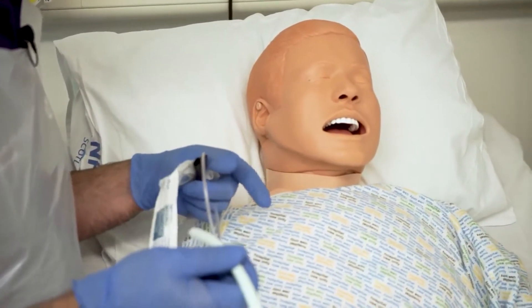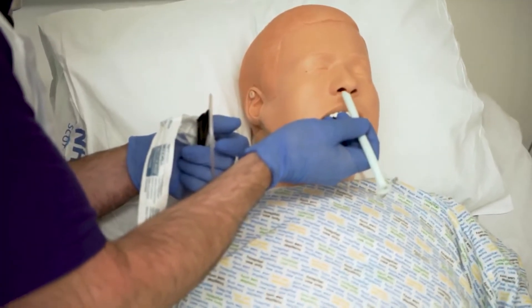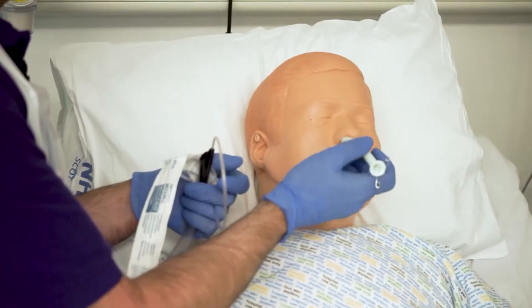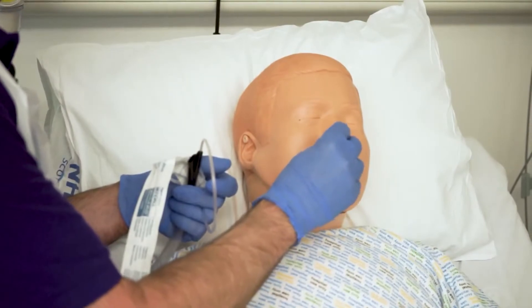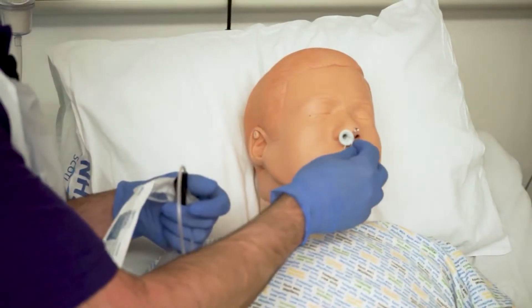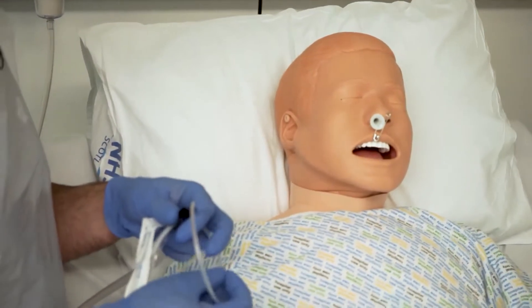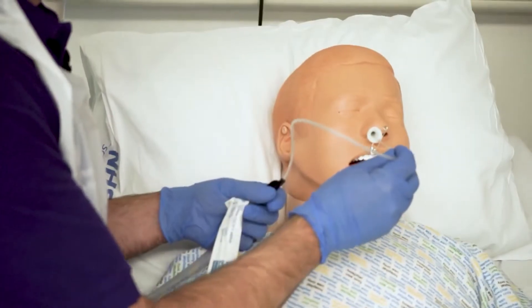The clearest nostril should be identified. If there's any other device already in place, we'll obviously have to go to the other side. We gently insert the airway into the nostril, moving the tube to a more upright then horizontal position and gently advancing. If you're having to apply a lot of pressure, stop. A small amount of blood streaking is normal; heavy bleeding is a problem and you need to get help. We now have a track down which we can pass the suction catheter and help the patient to cough.